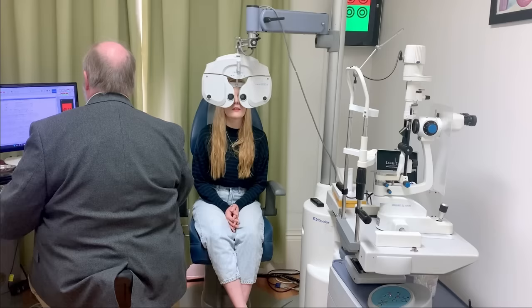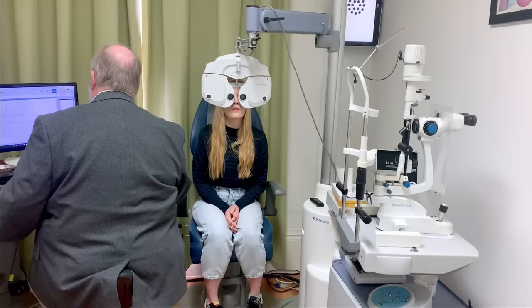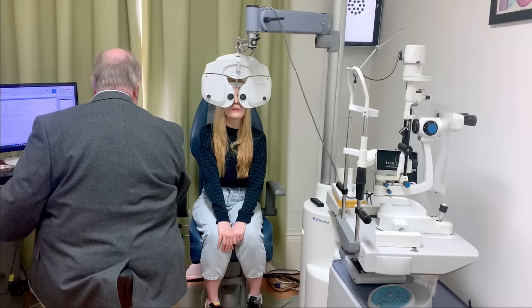And we'll go dotty again, okay? There we go. Is it any better with that first lens? Second lens? First a bit better, yeah? And let's try any better with three? No, it's quite blurry. Or with four? Oh, four is great. Four's good, okay. Four is so clear.